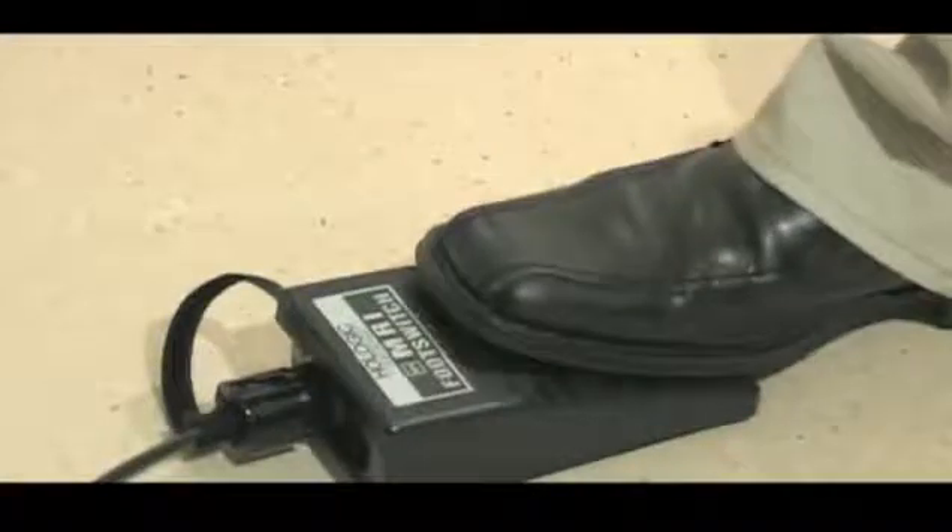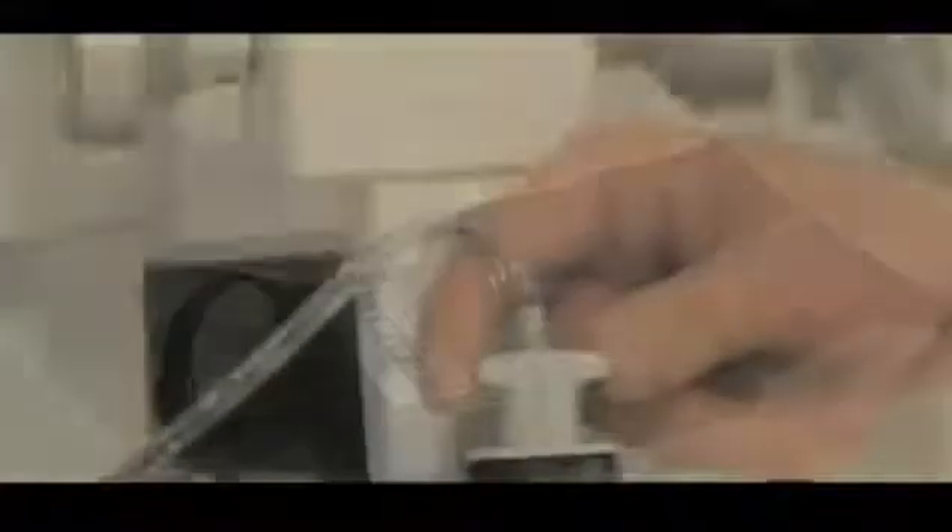The physician places their hand on the thumb wheel at the rear of the device and depresses and holds the foot pedal to activate the biopsy system throughout the tissue acquisition sequence. Tissue acquisition occurs every four and a half seconds. Typically, six to eight core samples are adequate for pathology purposes. An audible beep indicates that you are at the end of an excisional cycle and that it is safe to turn the device to the next clock position.